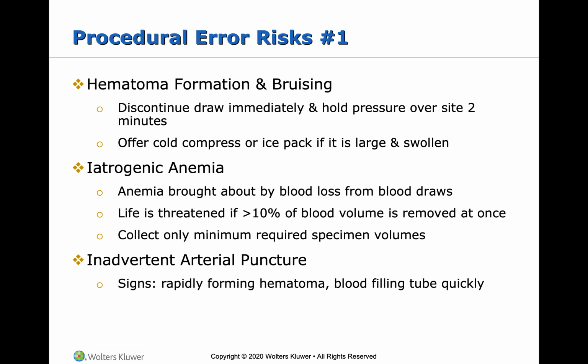So it is super important to make sure, like we talked about in class, that you are keeping track of it by weight. So I'll post the infant draw chart on Moodle along with that picture that I talked about. It goes by weight on how much you can take from the patient. So if a 3-year-old comes in and a doctor wants 17 different tests on him, and you might only be able to collect for 3 of the tests, you always want to be sure that you're not removing too much.